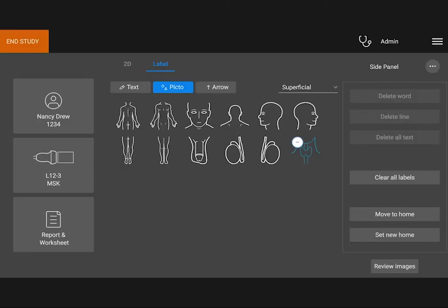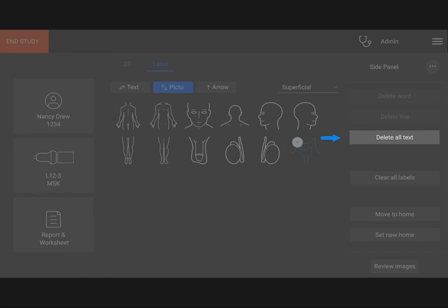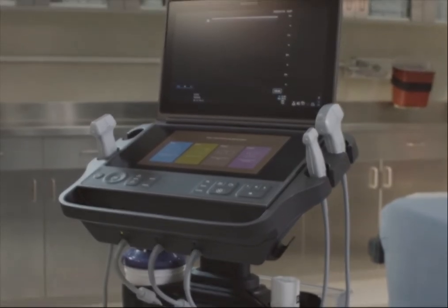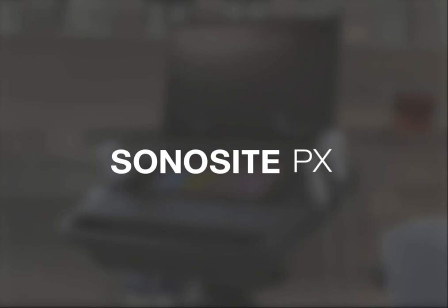You can delete all labels on screen by tapping Clear All Labels, or you can delete just text labels. Other options include choosing a new home position for your labels. Now it's time for you to explore on your own. Watch the help videos or refer to the Sonosight PX User Guide.